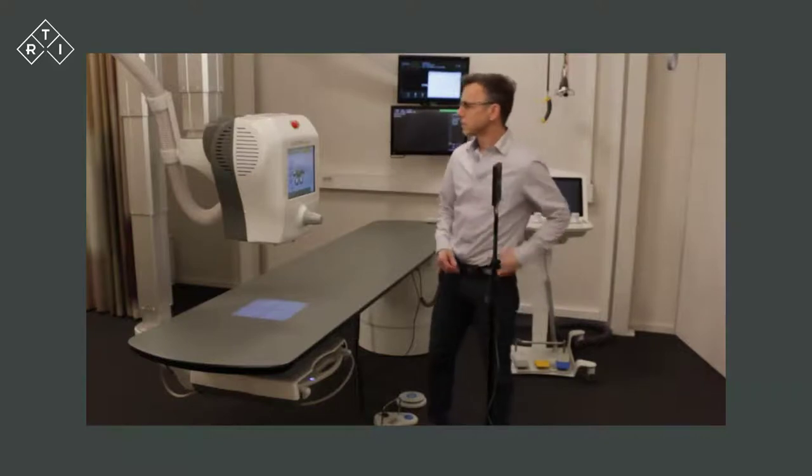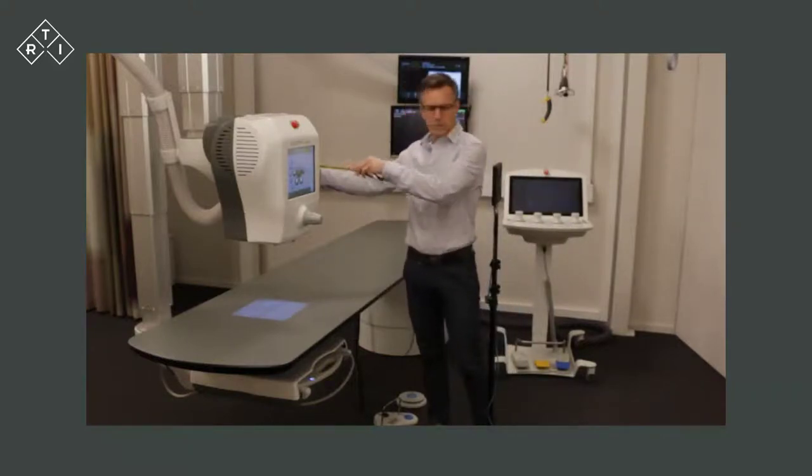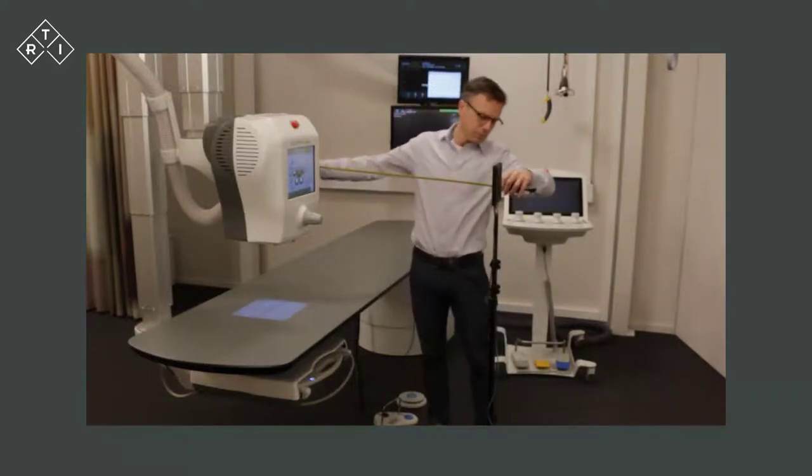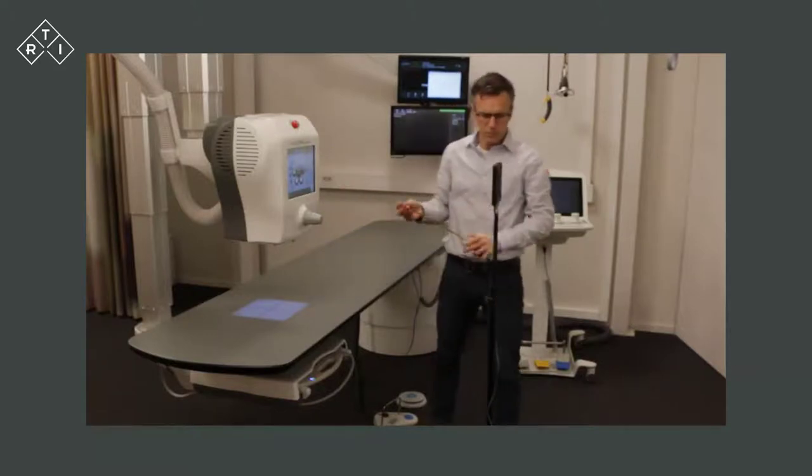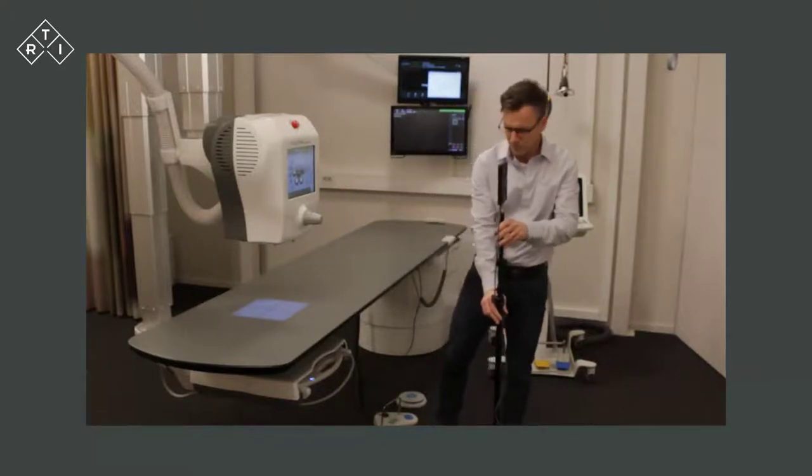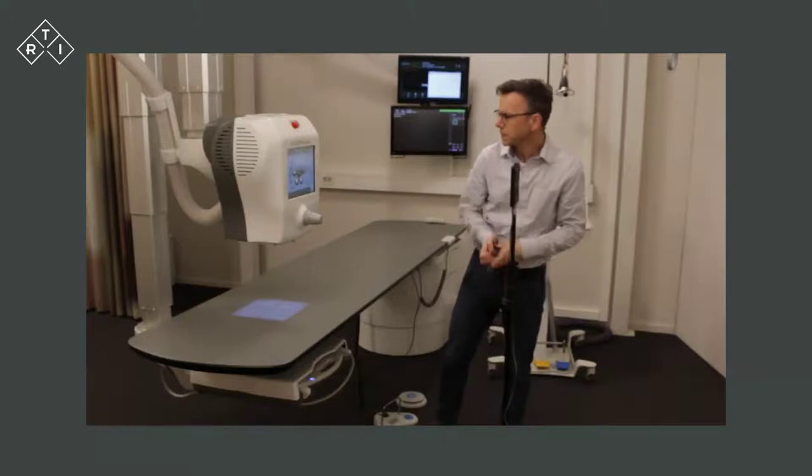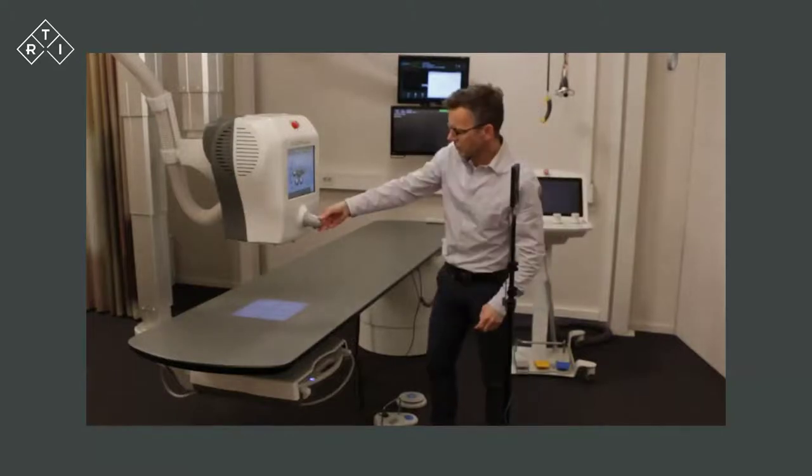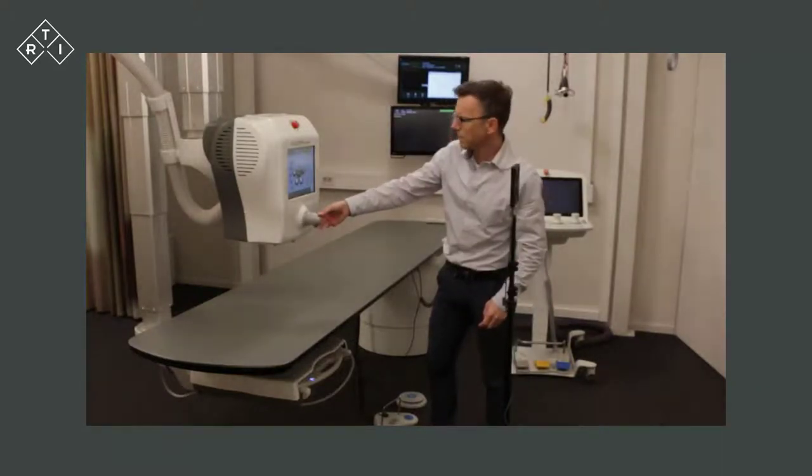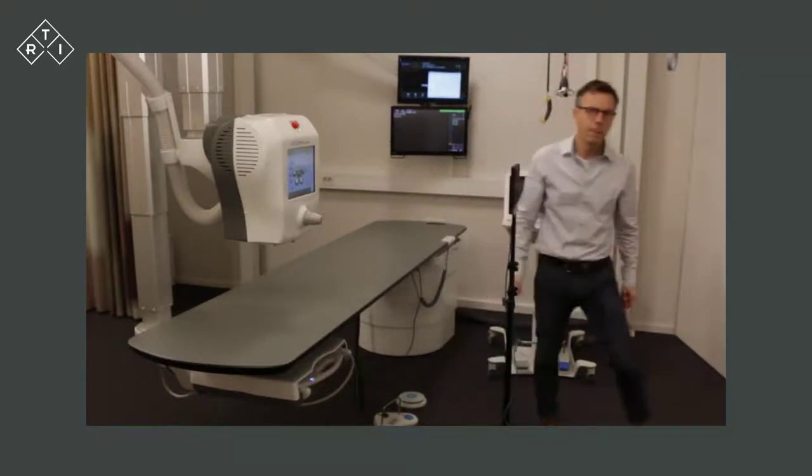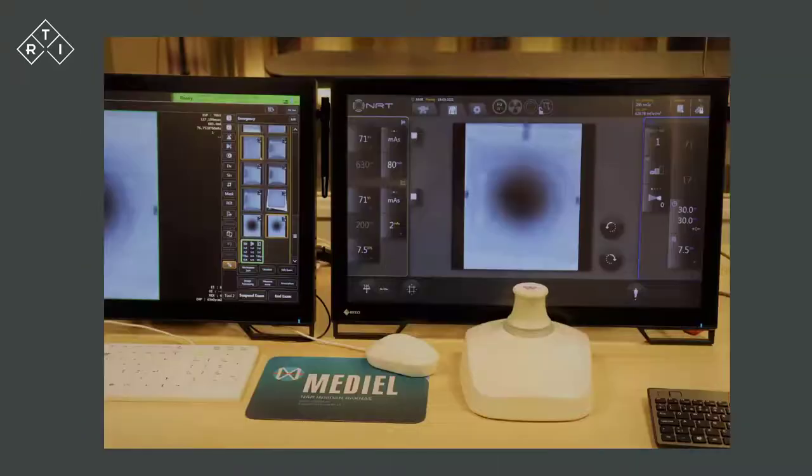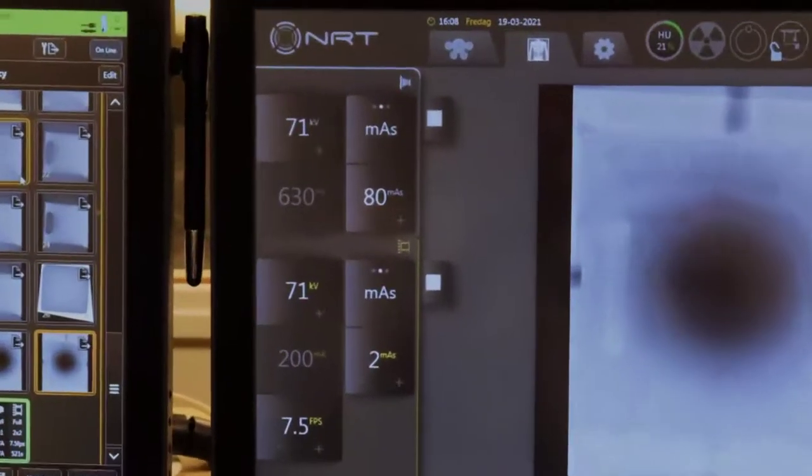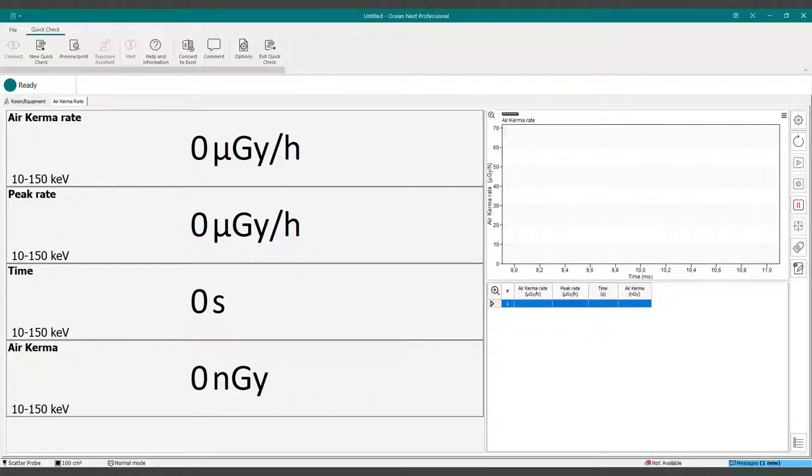To measure the tube leakage, the RTI Scatter Probe is placed at a distance of 1 meter from the focal spot of the tube. The collimator is then fully closed. The X-ray system is set up with the technique suitable for leakage testing.